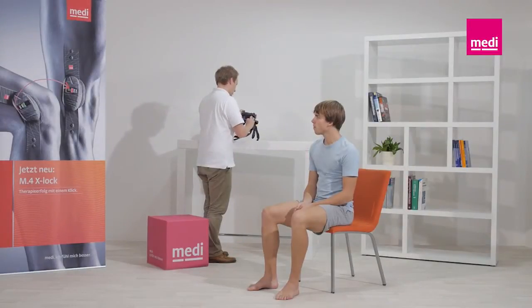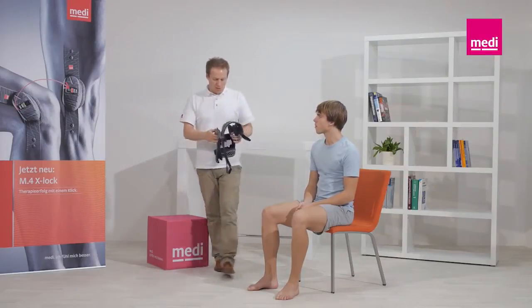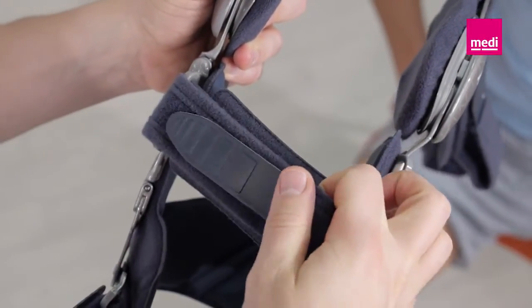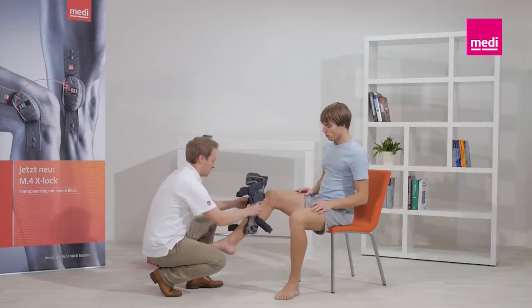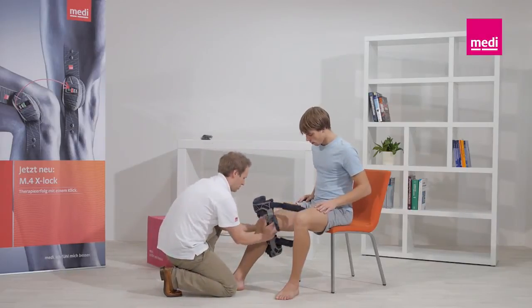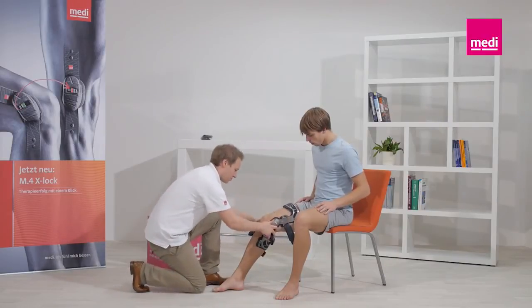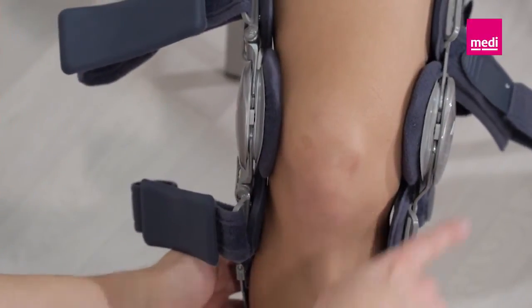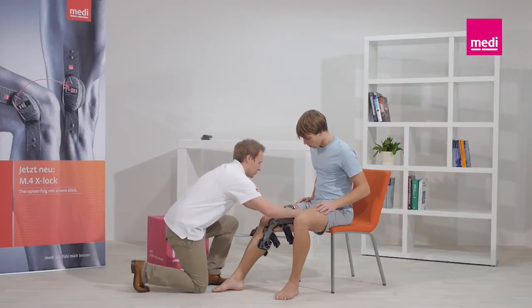The orthosis should be worn directly next to the skin to ensure the best possible fit. Make sure that all the straps are open. To prevent incorrect fastening of the Velcro straps, it is recommended to close them again afterwards. It's best if the patient sits on the edge of a chair. Pull the orthosis over the leg and bend the knee to 45 degrees. Position the orthosis so that the middles of the hinges are at the level of the superior border of the kneecap.